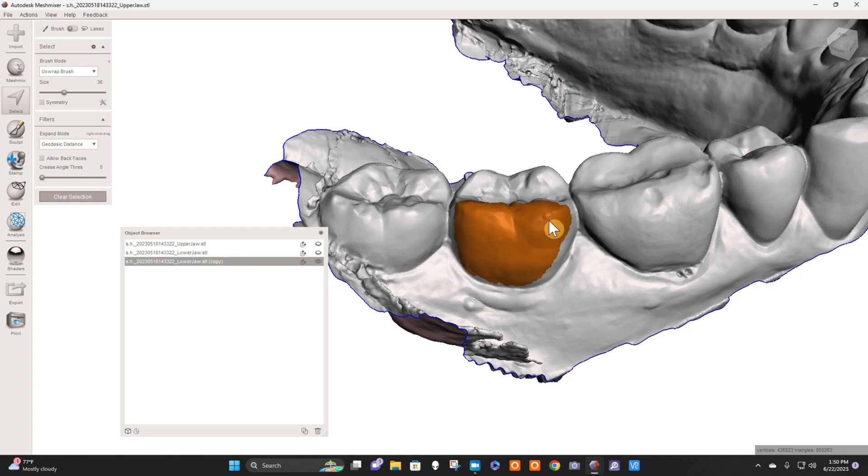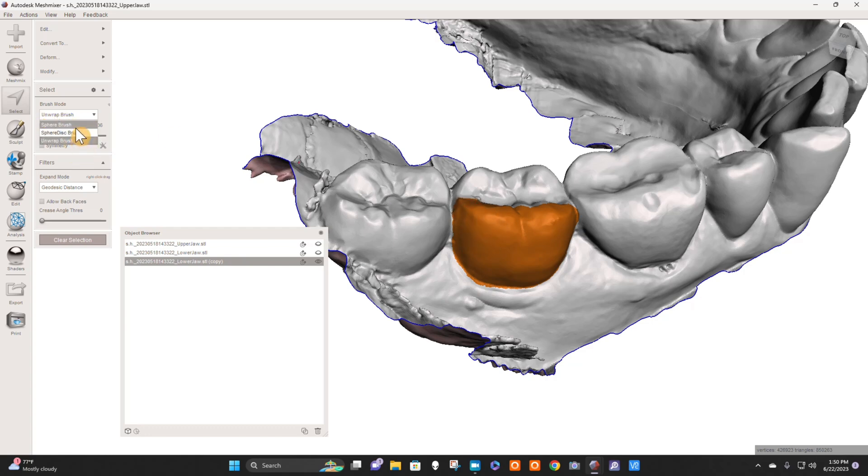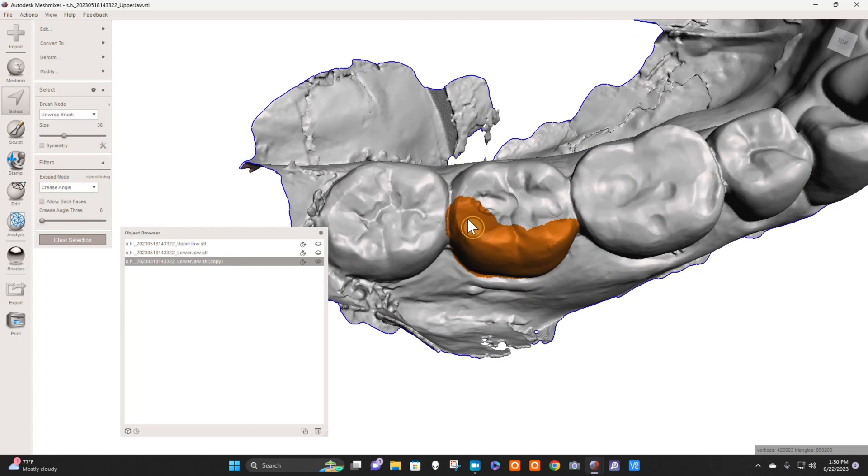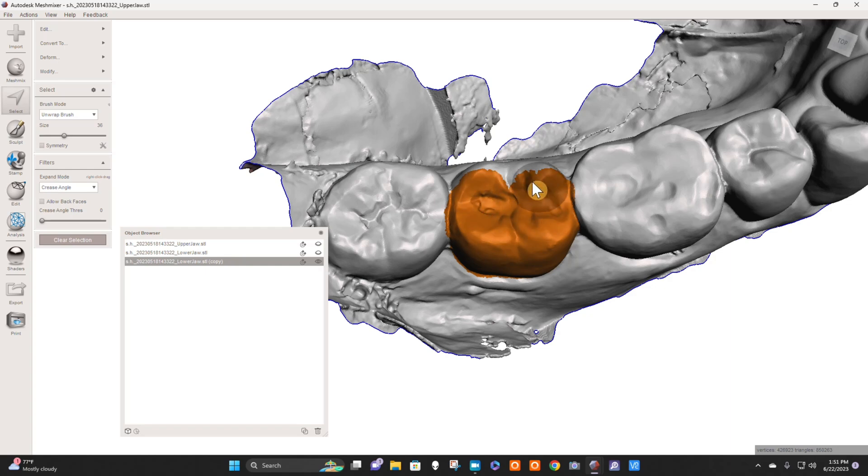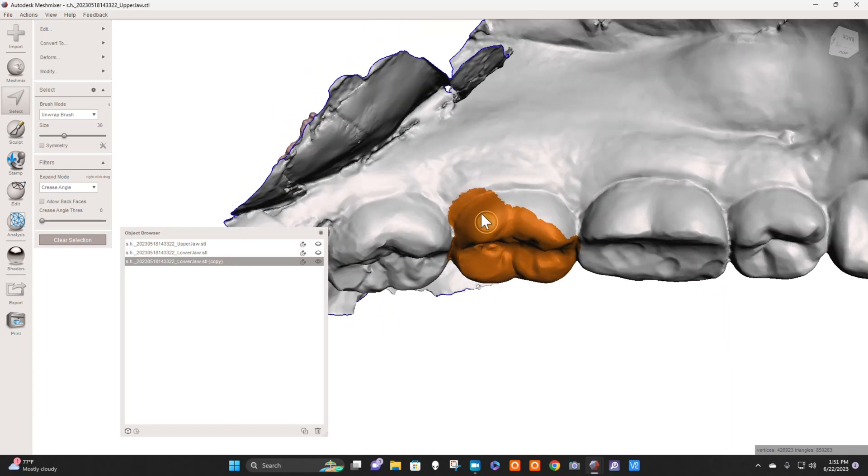You can select a tooth in multiple different ways. The best way I find is just coming here and hitting Select. You could go by crease angle here. If you switch to crease angle, sometimes that helps. You're taking this tooth and selecting it with no voids in the orange.